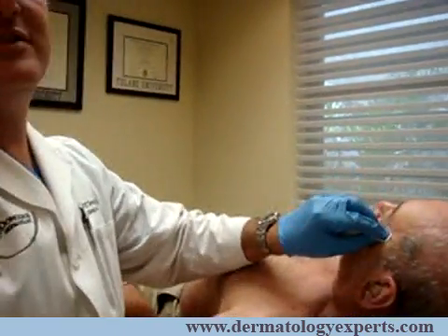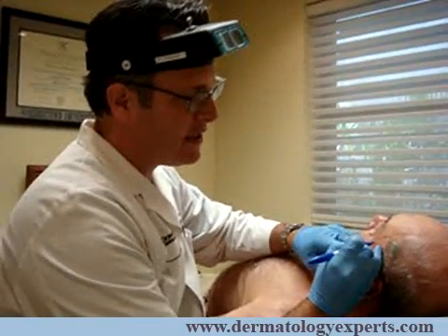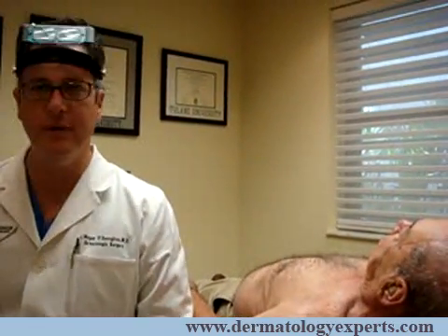The first thing I'll do is cleanse the area with a little alcohol pad. I'll localize the area with a little gentian violet pen — a blue pen — just to mark the area and locate it for when I take a photo. That way I know exactly where that lesion is.